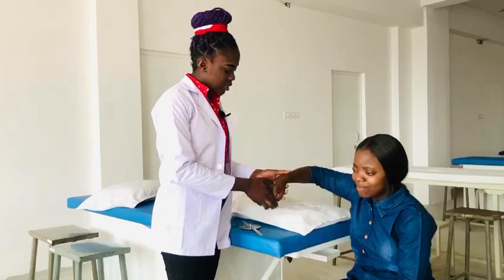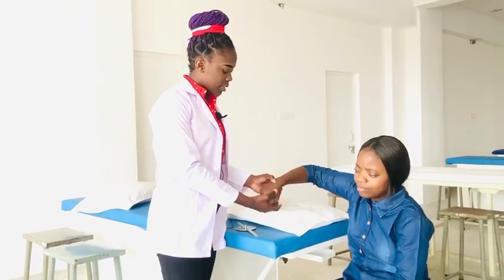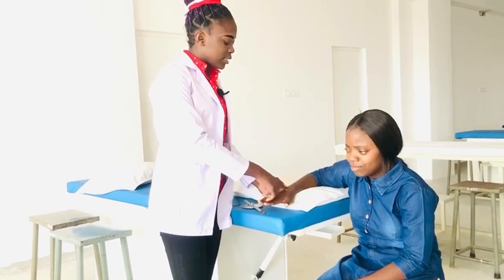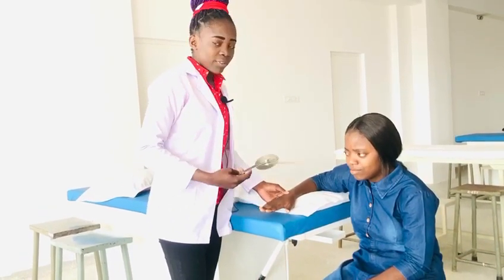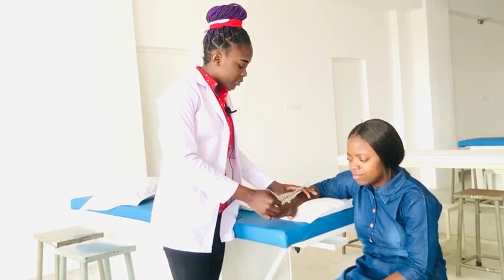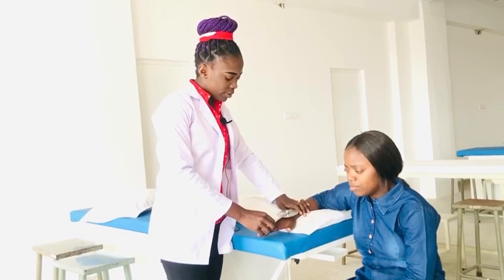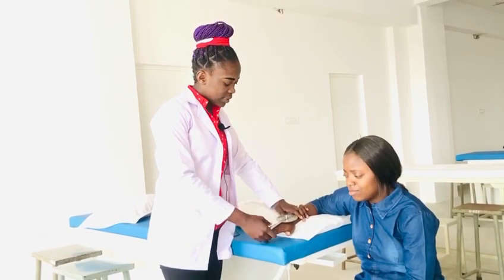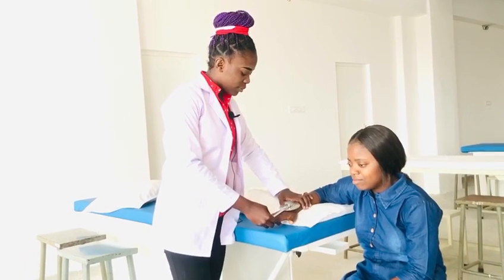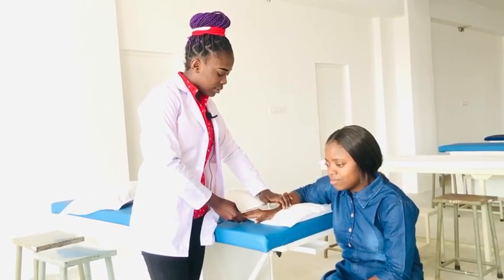This is how to palpate the capitate. The axis will be on the capitate, the non-movable arm will be on the midline of the forearm, and the movable arm will be on the third metacarpal. Then perform ulnar deviation like this.